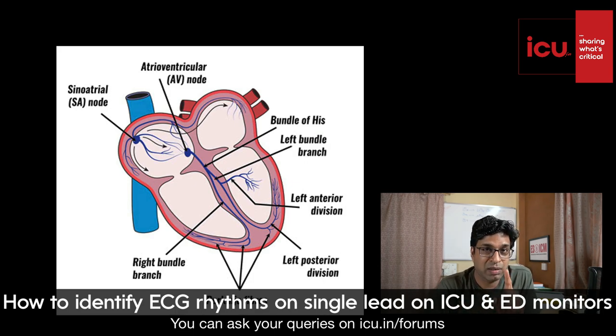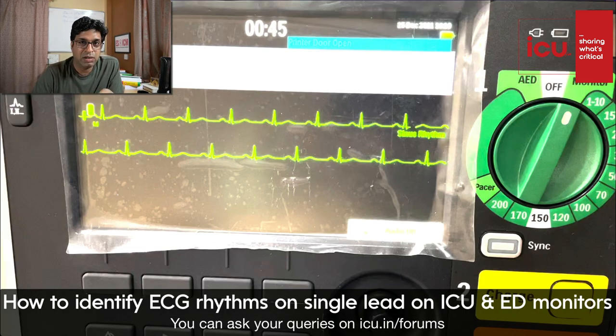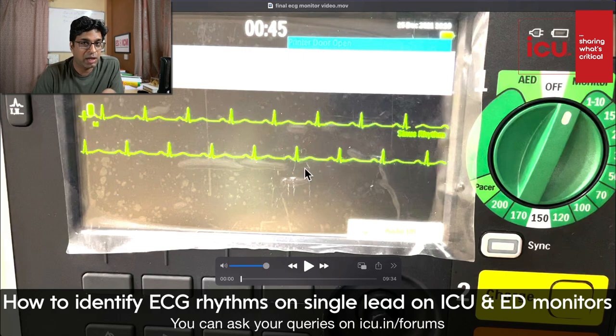One more thing, the fourth one you need to remember: any rhythm originating in the atria other than the SA node is called an atrial rhythm, whether it is atrial tachycardia or atrial fibrillation or atrial flutter. If it is not originating from the SA node, then it is called an atrial rhythm. You got this? Now we'll see the simulator. This is our simulator, and for the next 10 to 12 minutes we'll focus on identifying the rhythm.